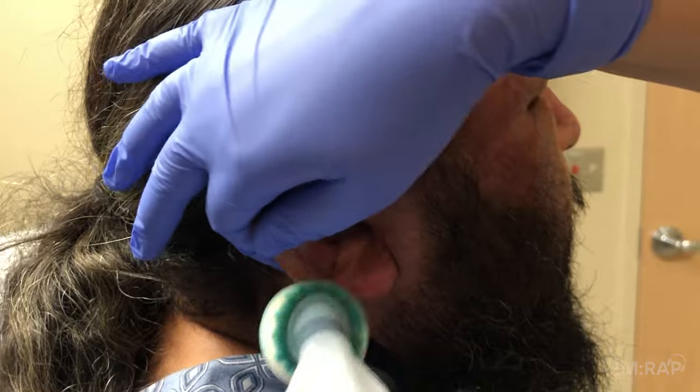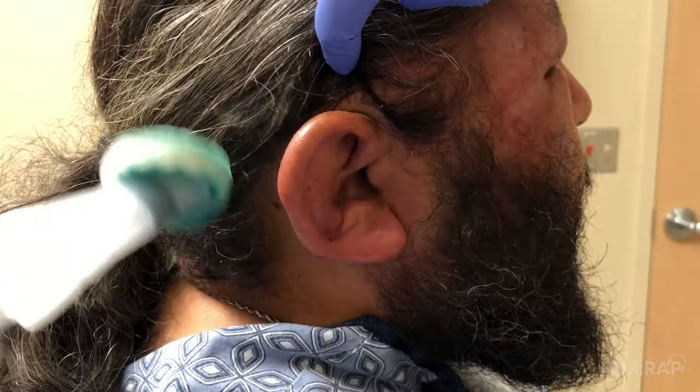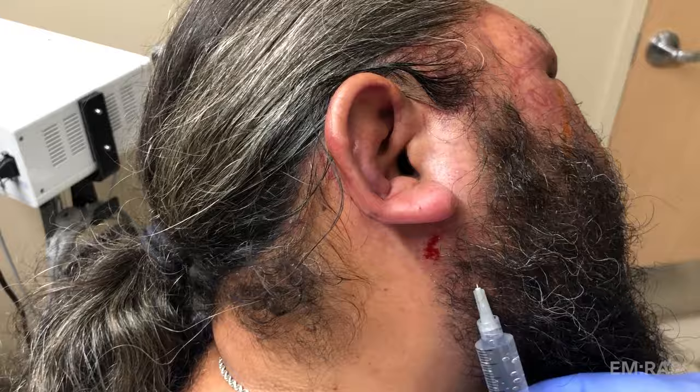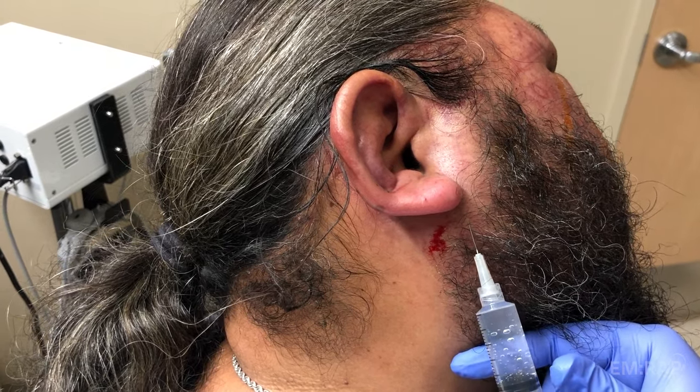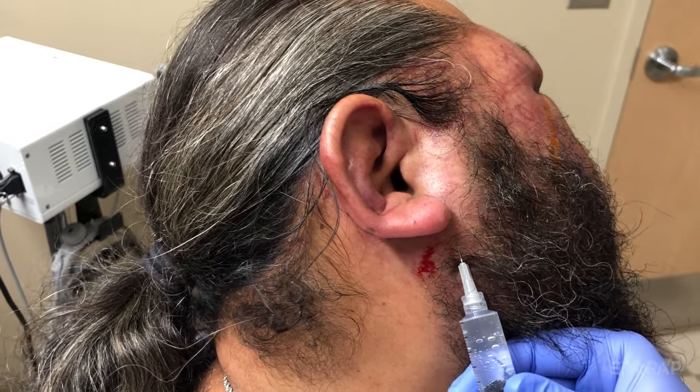Do a sterile prep of the entire ear and the area around the ear where you're going to perform your auricular block. We did a whole separate video that describes in detail how to do the auricular block, but if you want the brief version, here it is.